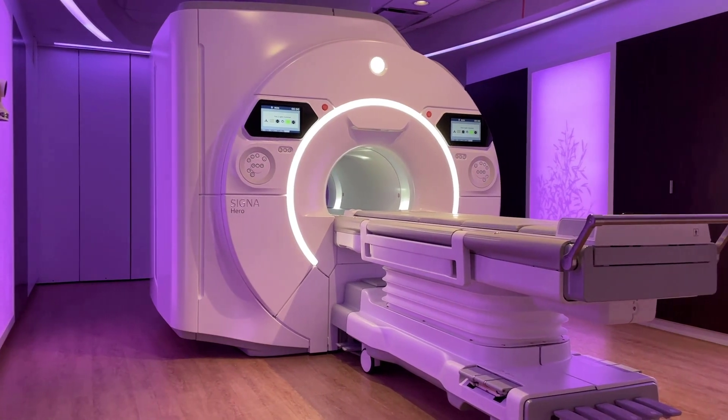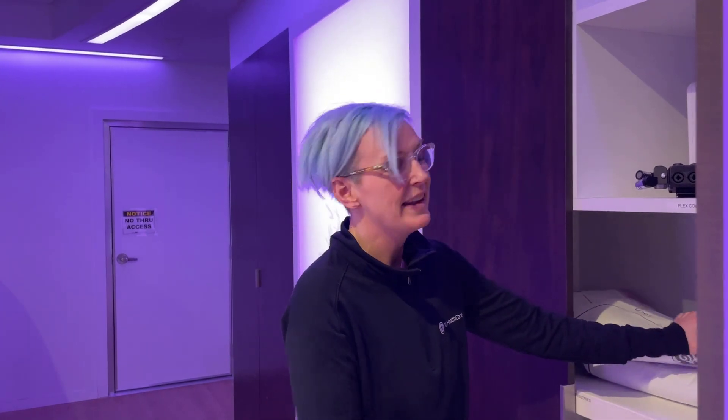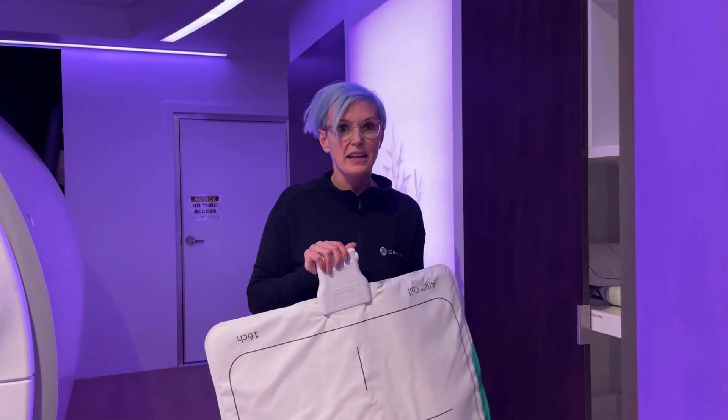Today we'd like to share with you some of the enhancements to the air coil. I want to take you in the scan room and just show you how air coils benefit you in your daily routine and also benefit your patient. I want to show you an advantage of the air coils — I just go ahead, open up the cabinet and grab one coil. It's so much easier than working with dedicated coils.